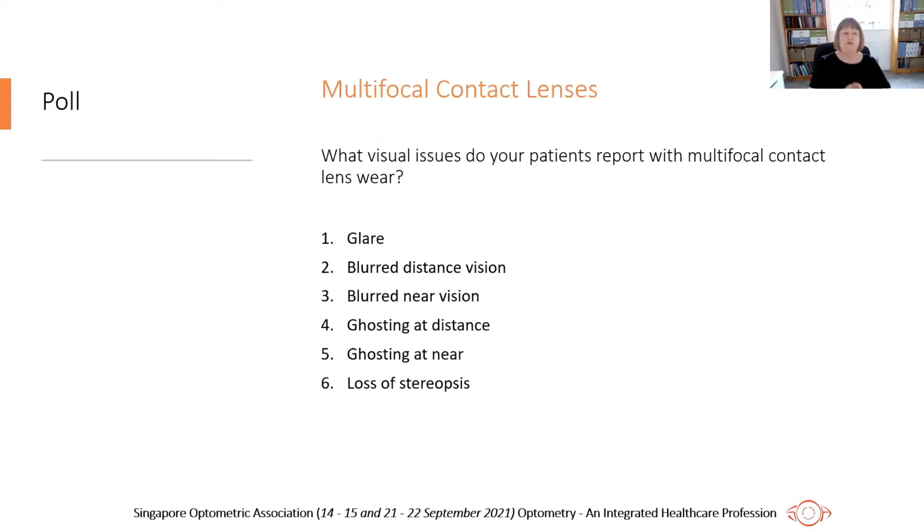So at this point, we'll just stop for a poll now to ask you, with your multifocal contact lens fitting, what issues do your patients report with multifocal contact lens wear? Glare, blurred distance at distance and near, ghosting at distance and near, or loss of stereopsis.